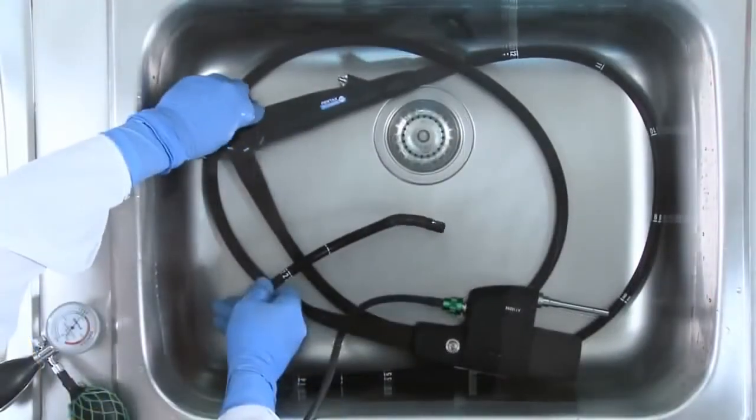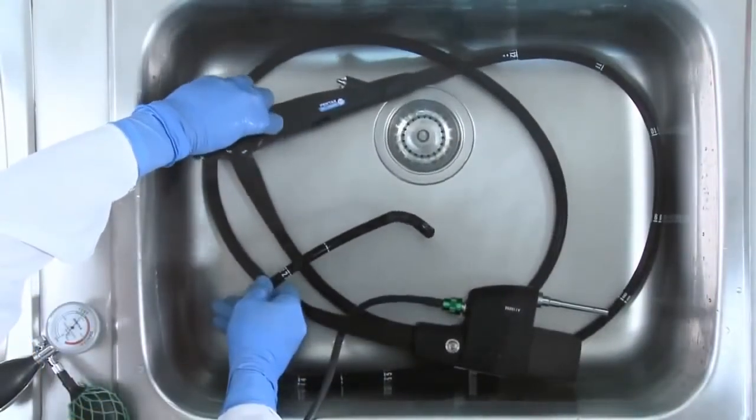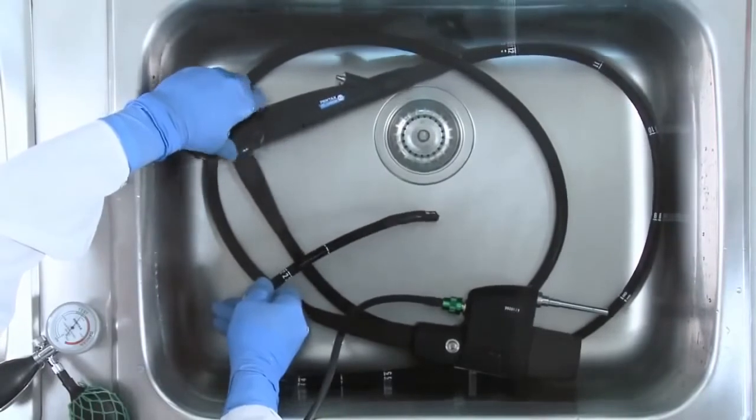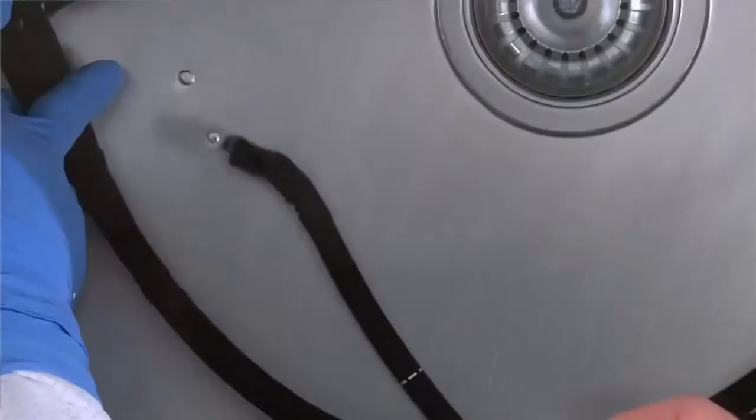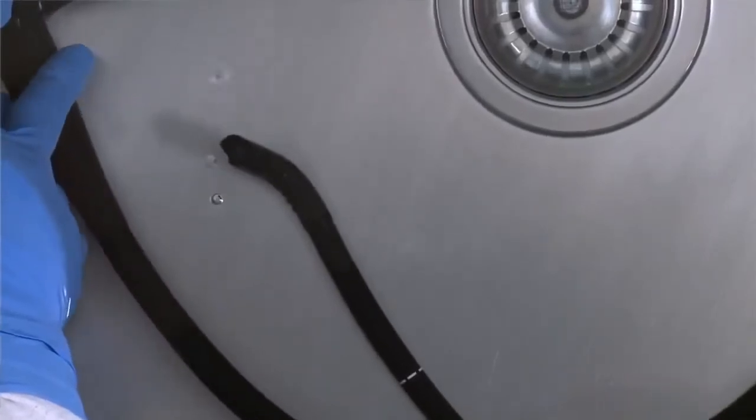Next, deflect the distal tip in all directions while alternately looking at the leak tester gauge for movement of the needle and looking for bubbles in the water, particularly on the exterior of the bending rubber.